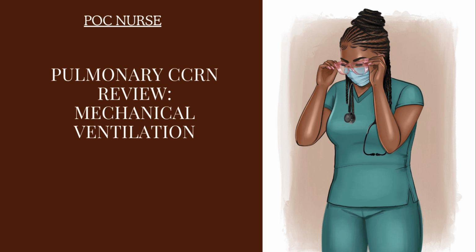So when the alarms go off, they may go off because there is high pressure in the patient or because there's low pressure in the patient. If the ventilator is beeping and giving you a message that has something to do with high pressure, a couple of things to think about as you answer the questions on your CCRN exam, and depending on the options that you get, are these. Could the patient be agitated? Could the patient be coughing? If the patient is coughing, they may be blocking the vent.